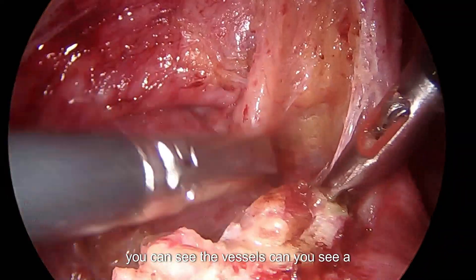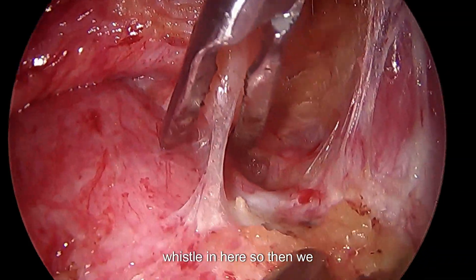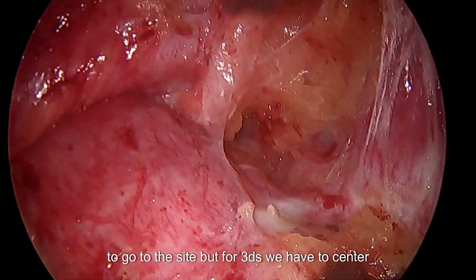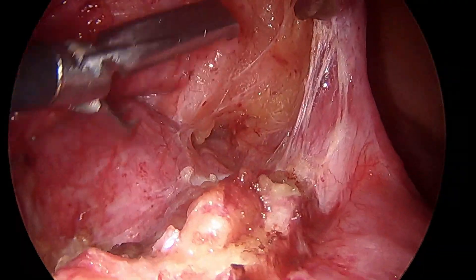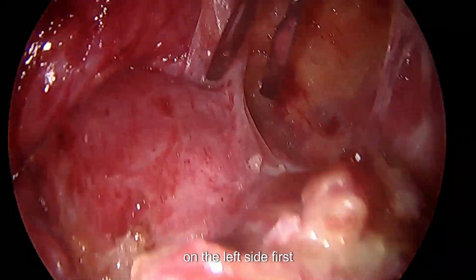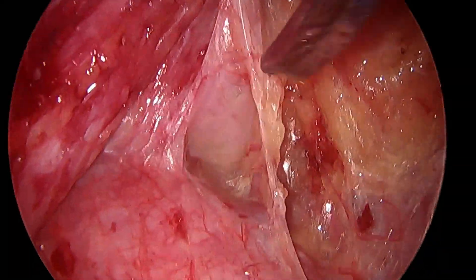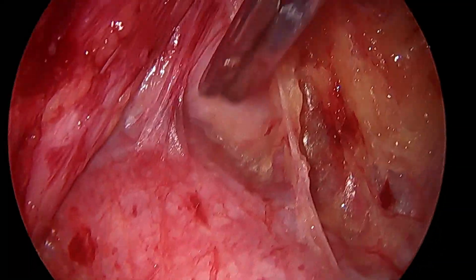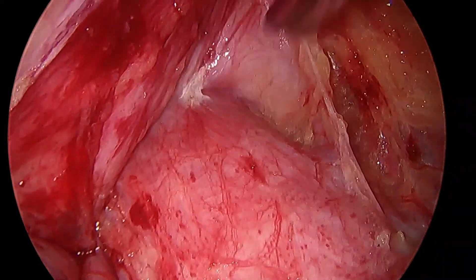You can see the vessels. Can you see a vessel in here? So we are going to have a lateral window on both sides. But fortunately we have dissected the bladder on the left side first. And we can present the entire bladder now. And this is the area of the vagina.